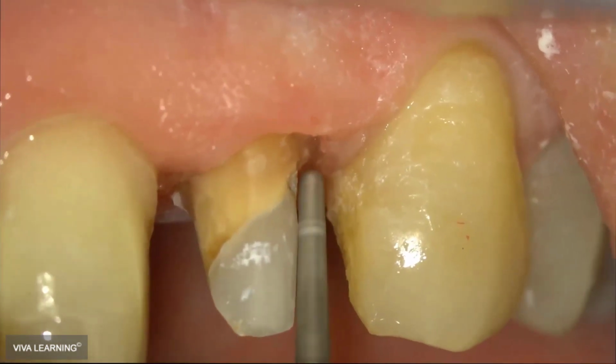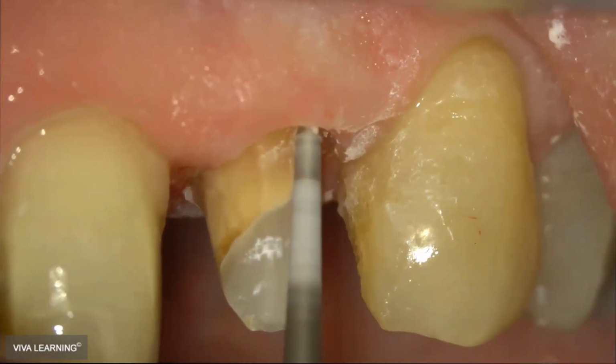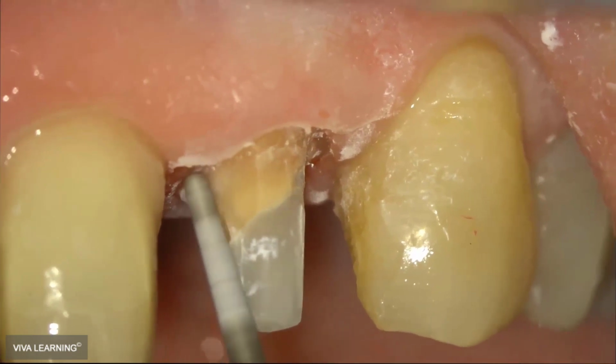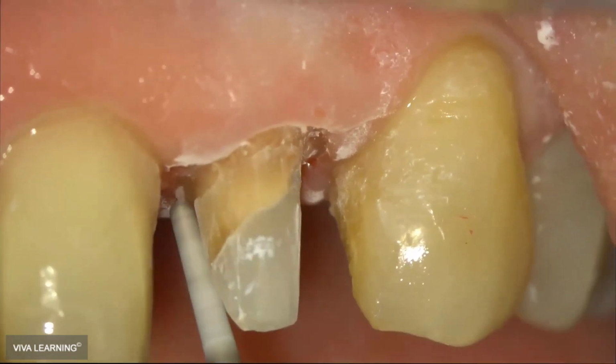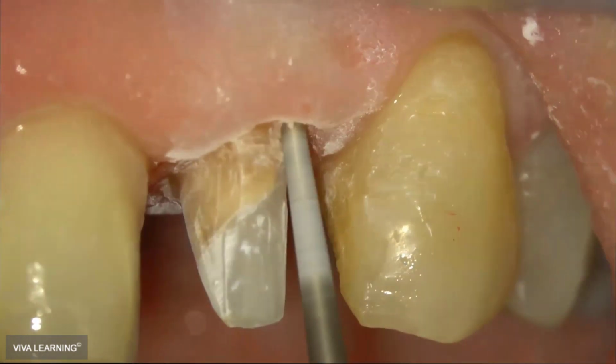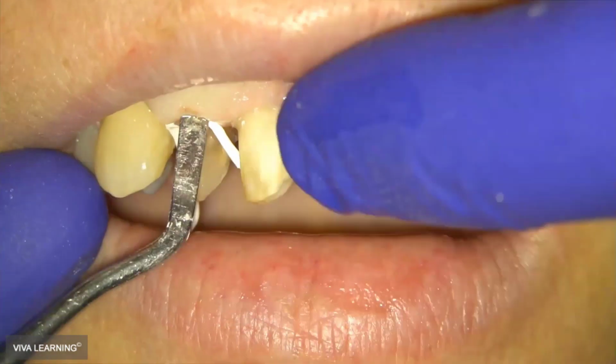So in this case, you will see here that by prepping subgingivally with a very fine burr, even if you touch a little bit the tissue, the bleeding will be minimal, and it will be very easy to control it with retraction paste.